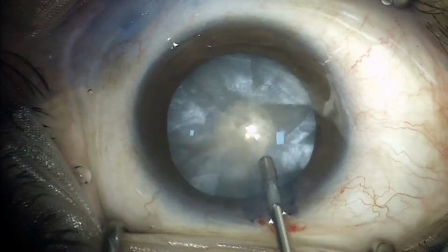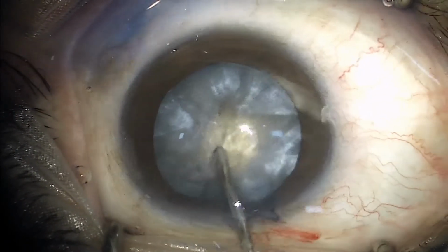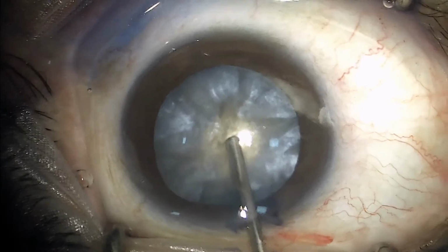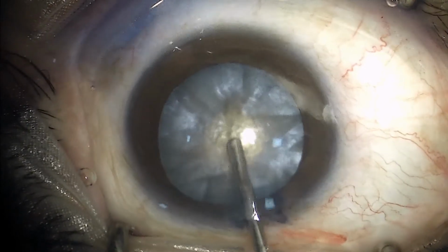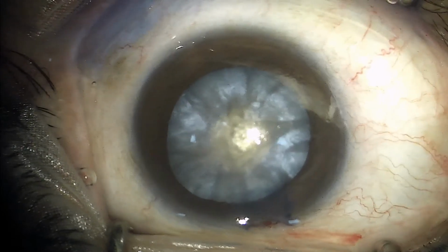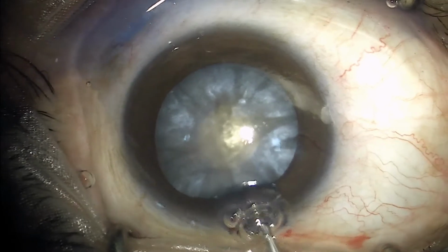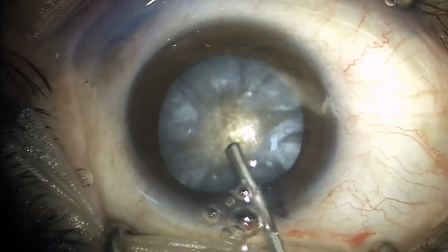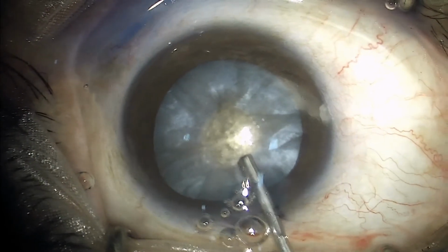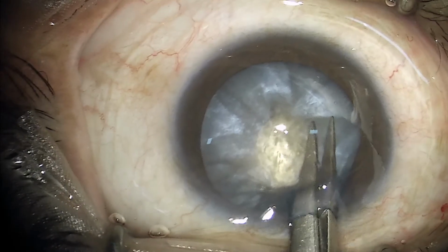Going ahead with the cannula on a syringe, aspirating out whatever I could, but this could cause some hypotony in the anterior chamber. Now we are proceeding to make the standard size rhexis. So instilling some viscoelastic material to reform the anterior chamber and performing a nick in the capsule using a half scissor.